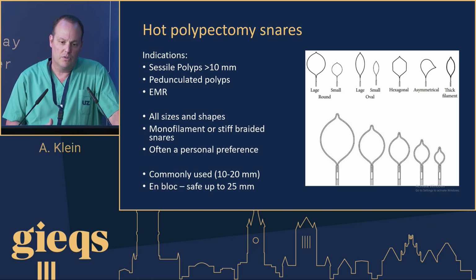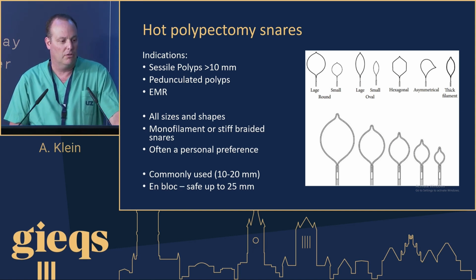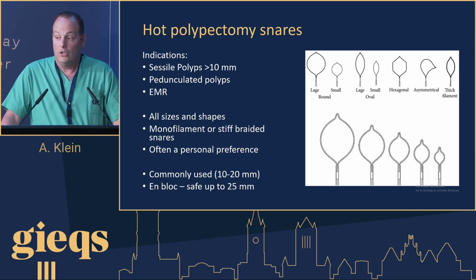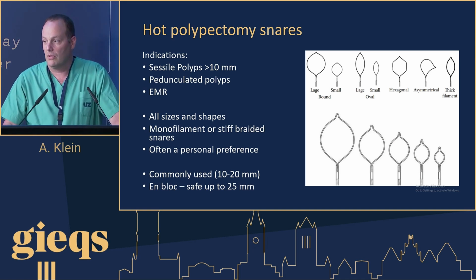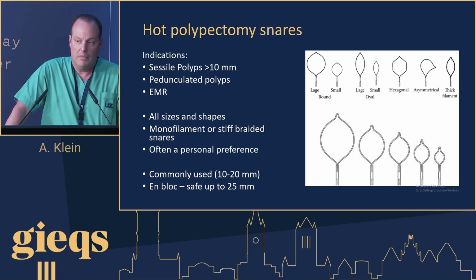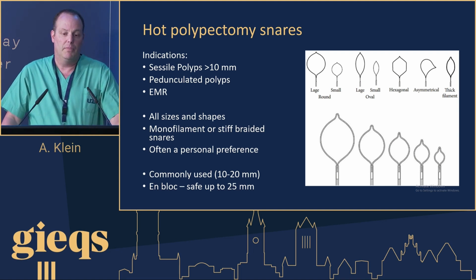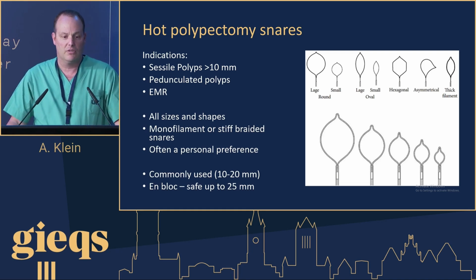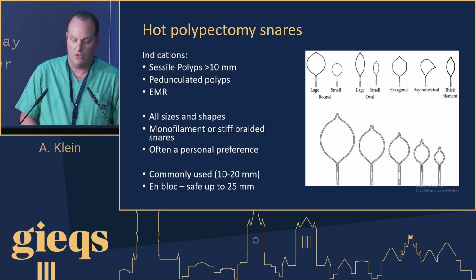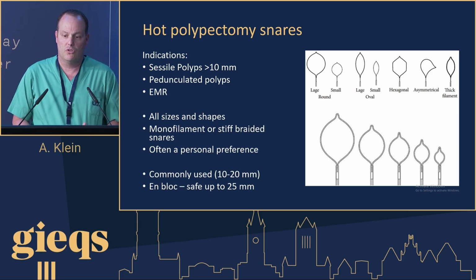You often use the braided snare when you have a flat polyp because it tends to slip less than a monofilament snare. You also need to know that when you're using cold snare, although Michael mentioned this today, there is no complete or very strong data to show that for cold snare polypectomy you should be using dedicated cold snares, but I think most of us are using them. And the basis of a dedicated cold snare is that the wire is significantly thinner. So these are the main concepts that you should know about snares, and you should choose your own.